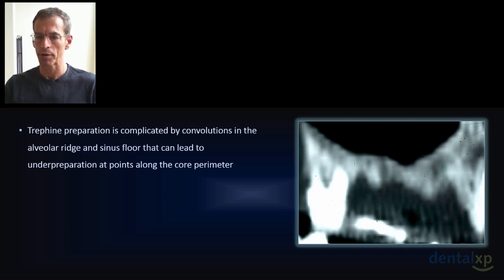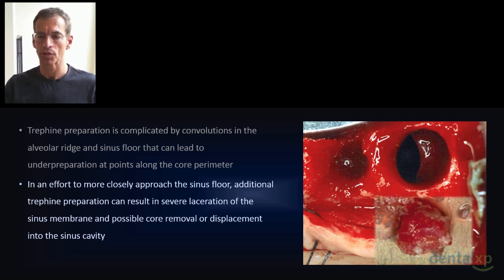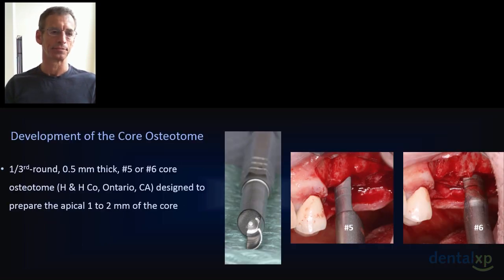points along the core perimeter. And in an effort to more closely then approach the sinus floor, additional trephine preparation can result in severe laceration of the membrane and possible core removal, as you see here, or displacement into the sinus cavity.